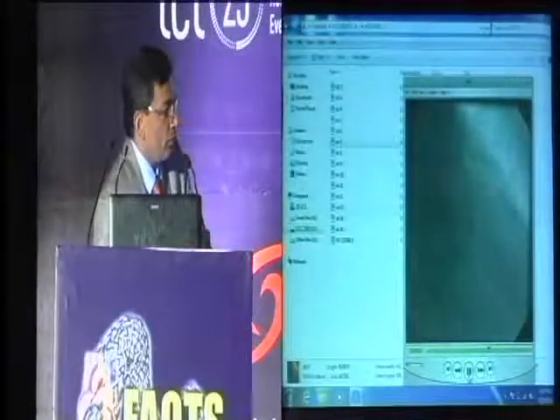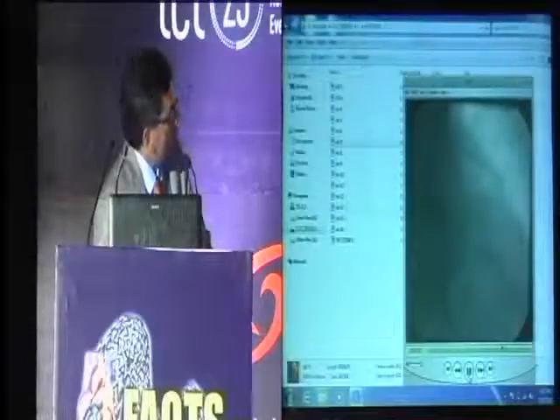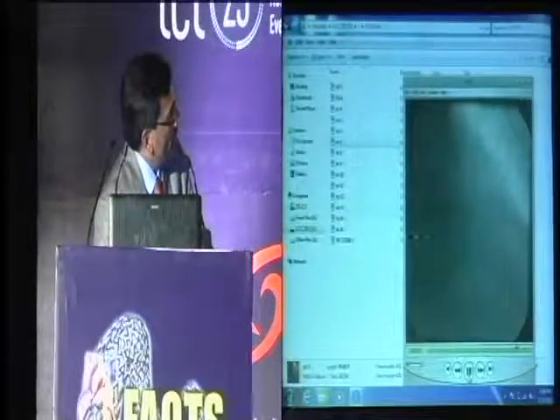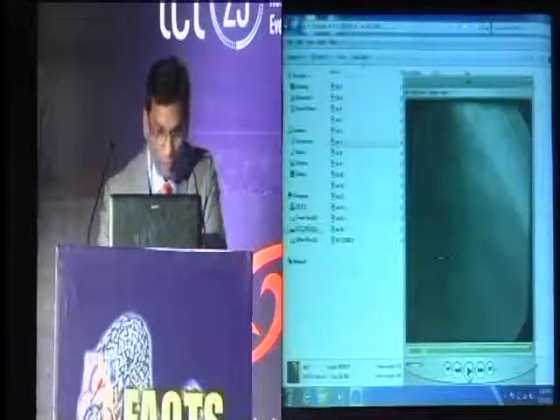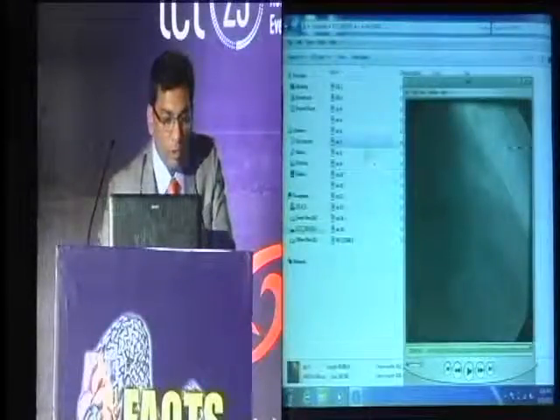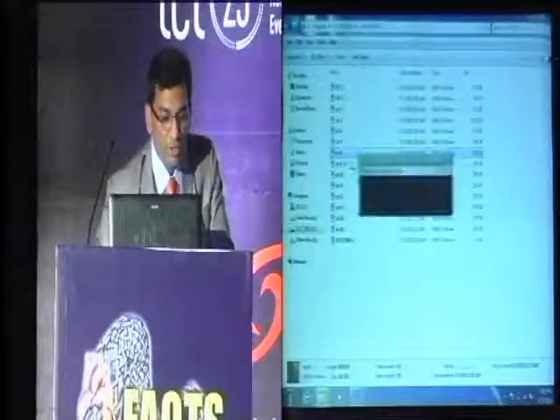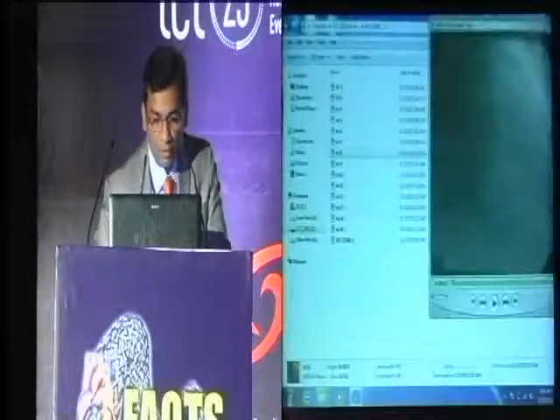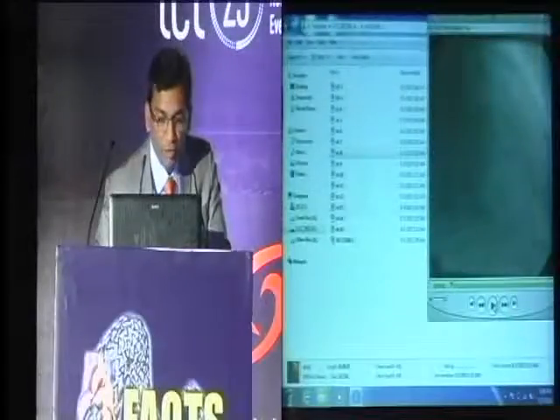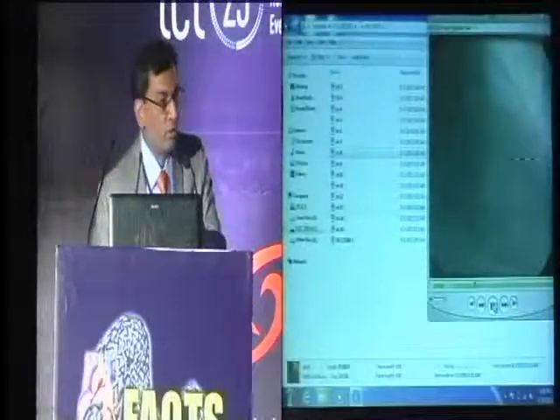Now we wired the diagonal and then did thrombus aspiration of the diagonal. The key is to do optimal thrombus aspiration, so you have a better understanding of the bifurcation.